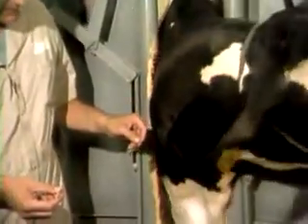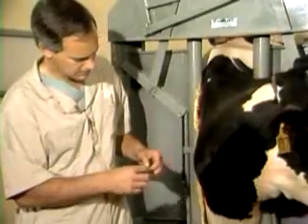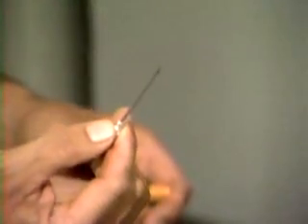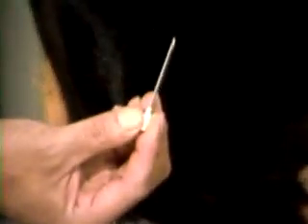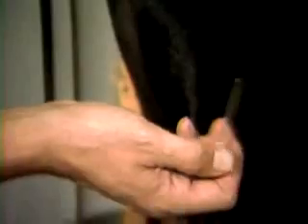Next we'll put a needle into the vein for administering medication. You can see how this cow changes the position of her vessel every time she makes a movement. So it's important to get a needle that is inserted well into the vessel some distance, so there's less chance the needle might come out as the cow changes position. We're going to use a 14 gauge 2 inch needle to have a maximum amount of needle threaded into the vessel. The maximum amount of needle enters the vessel if it goes in a perpendicular direction, then is tipped up and threaded down the vessel. If you go in at a very acute angle, you use up a lot of the shaft until you reach the vein, and then it's more likely to pull out as she changes position.